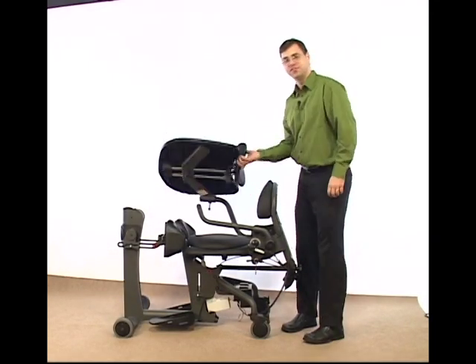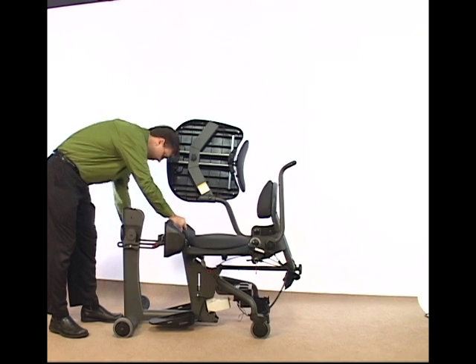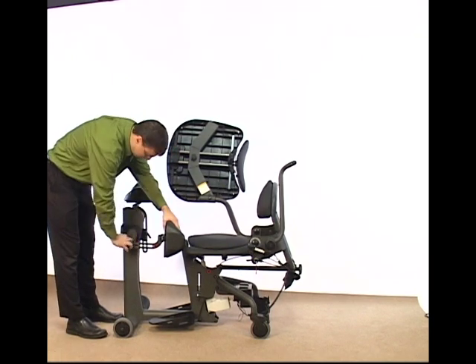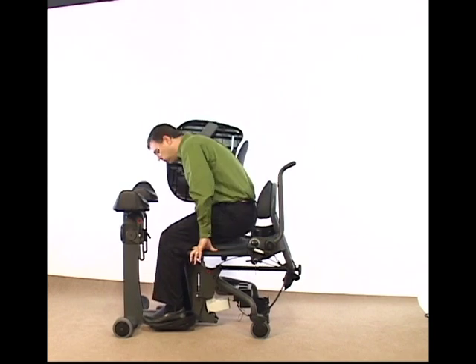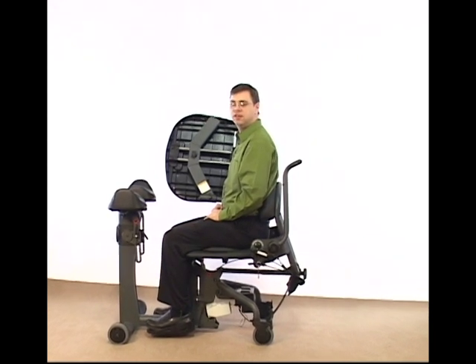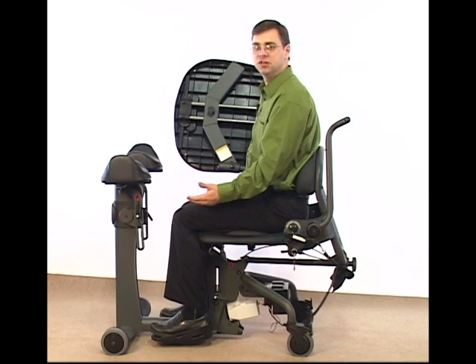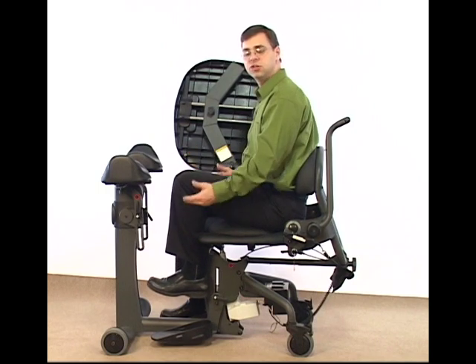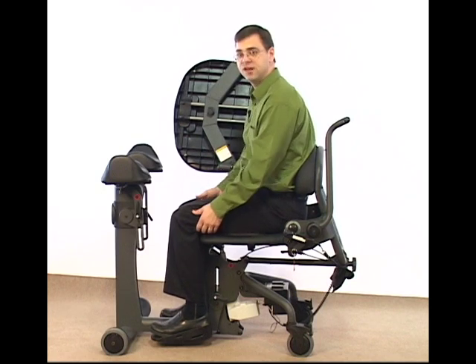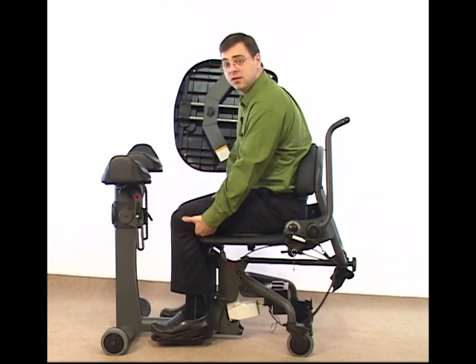Now let's take a look at what proper fitting looks like in the Easy Stand Evolve — I'm going to fit myself in this Evolve. When fitting a client in the Evolve, we want to make sure that the femur is laying all the way on the seat. We do this by adjusting the foot plates up and down. If your foot plates are too high, your knee position will also be high. Make sure you drop your foot plates to a height where your femur is resting all the way on the seat. In this case, I could lower the foot plates another inch because I still have space underneath my leg.